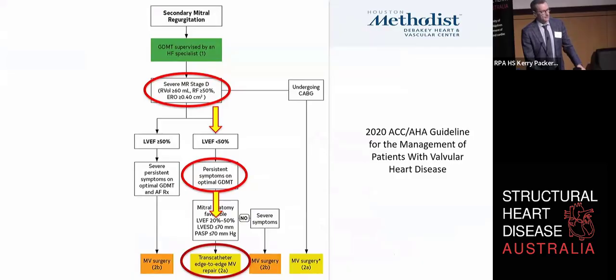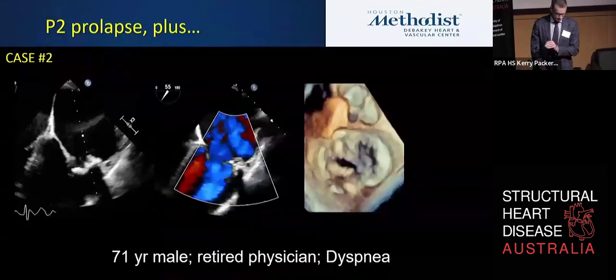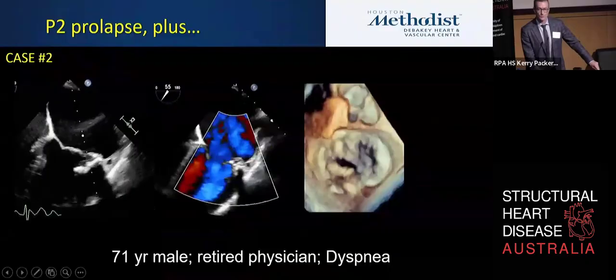Very, very dilated LV, mitral intervention is probably not going to be durable and helpful. But if you go down that pathway and think an edge-to-edge repair is a good thing to consider, let me show you a couple of cases. This is the worst type of patient.